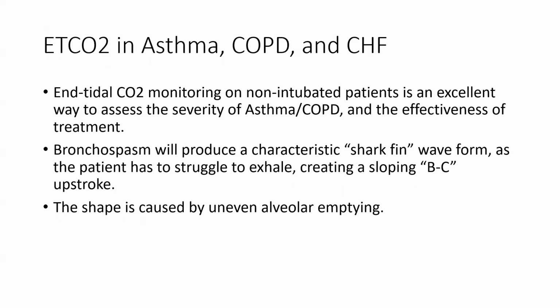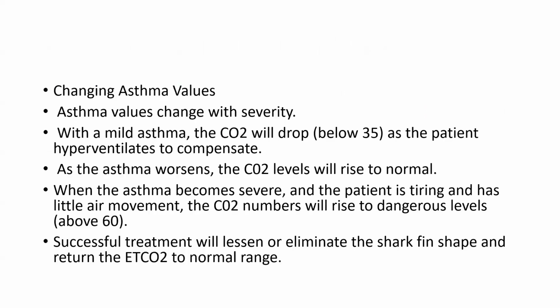Now, EtCO2 in asthma, COPD, and CHF. End-tidal CO2 monitoring in a non-intubated patient is an excellent way to assess the severity of asthma and COPD, and the effectiveness of treatment. Bronchospasm will produce a characteristic shark fin waveform as the patient has to struggle to exhale, creating a sloping BC upstroke. The shape is caused by uneven alveolar emptying. So this is the shark fin appearance seen commonly in obstructive airway disease, suggestive of asthma and COPD.